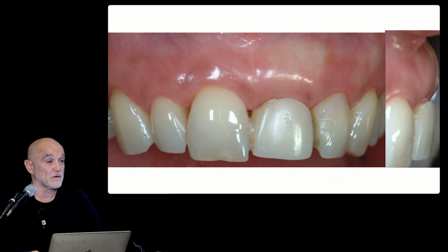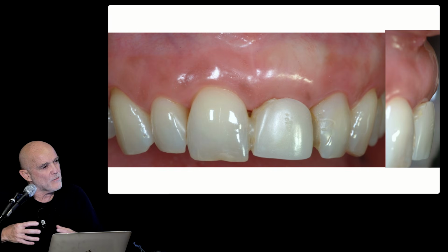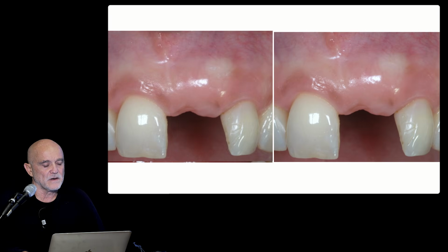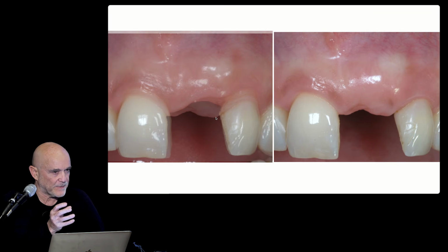Enormous amount of soft tissue augmentation in apicocoronal. And look, buccolingual. This is the temporary crown before being reduced. And look how much soft tissue was gained in the 6 months of healing after the platform. And so this is the condition of the papilla before and after. We gain 1 millimeter of papilla height above the papilla between the two centrals, and we gain 4 millimeters of papilla height at the level of the mesial papilla of the lateral incisor.